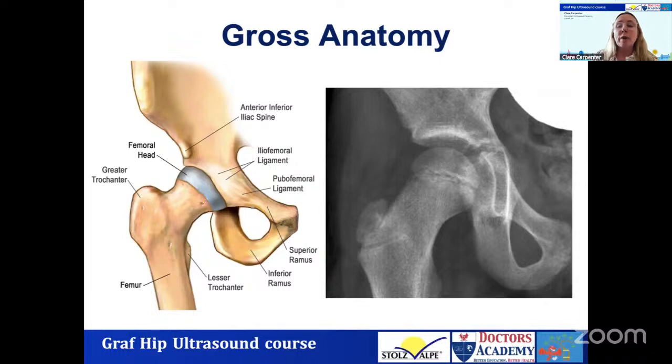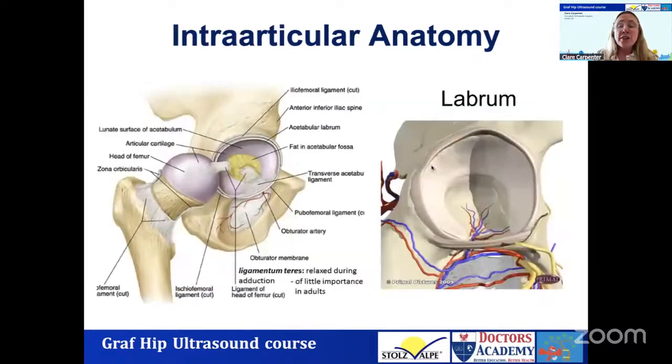And again, when we go back to anatomy, just to be clear that we all use the same terms, we talk in ultrasound anatomy with regards to the femoral head being centered within the acetabulum. There are a number of intra-articular structures that are visible within the ultrasound, and that is what makes it very useful to define the immature cartilaginous neonatal hip.